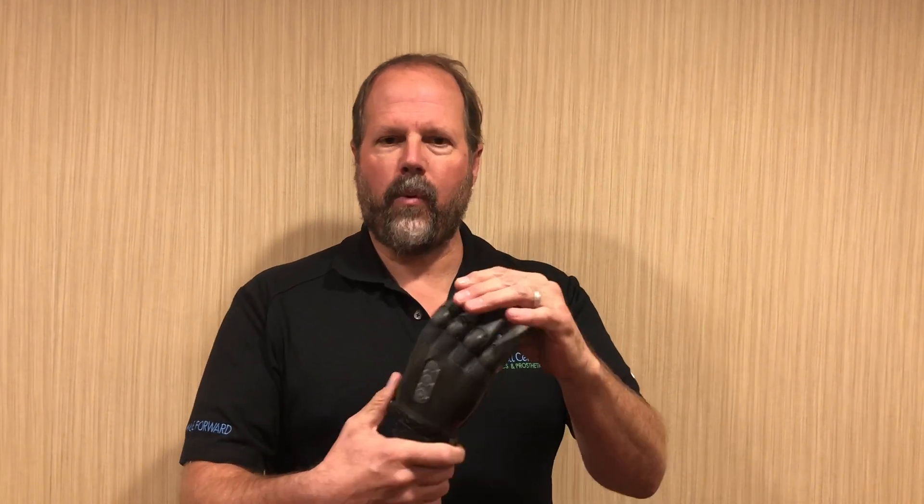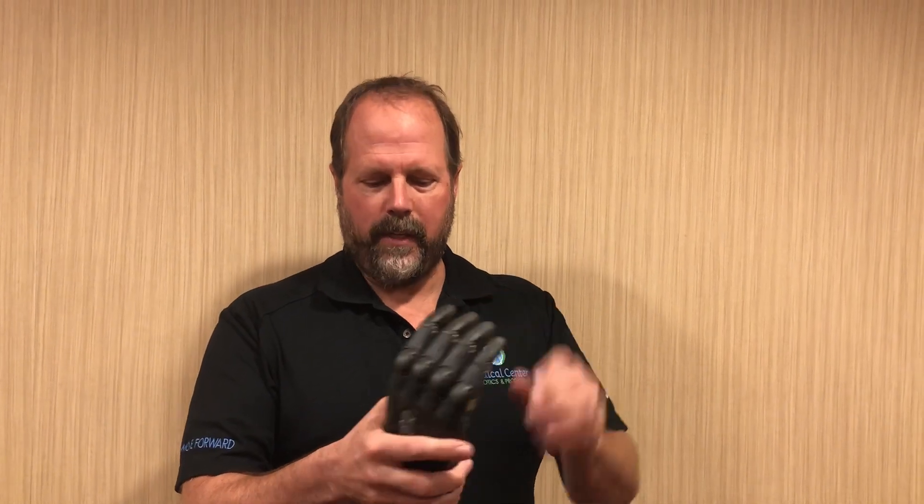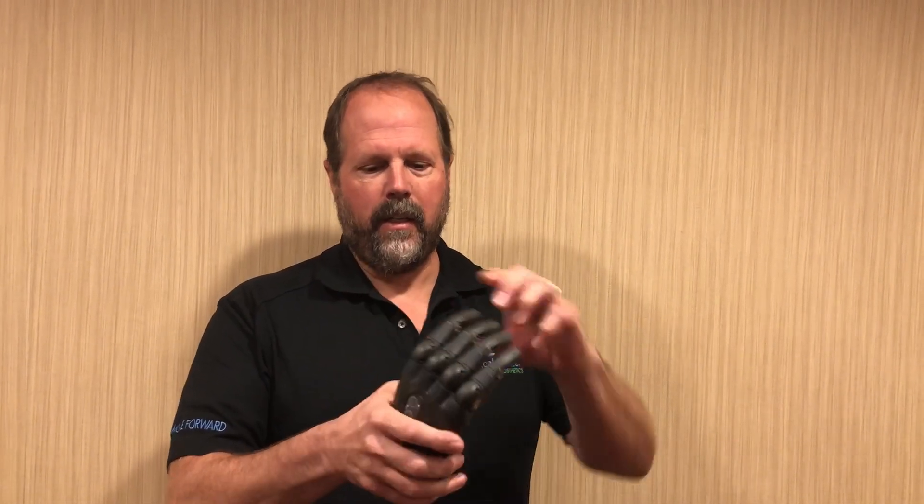Another nice feature of the hand is it has a breakaway joint at the fingers, so if the fingers get too much pressure the system can break away and it can just pop back into position. It saves the fingers and the hand from having to go in for repair. The user can just cycle the system and it'll lock back into position.